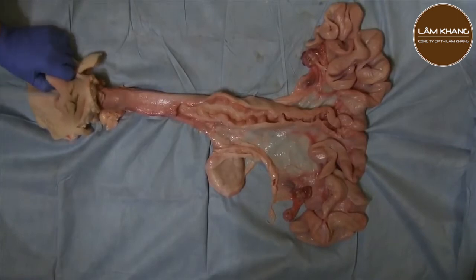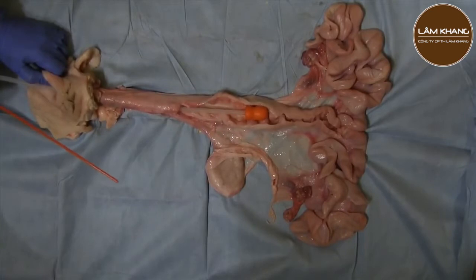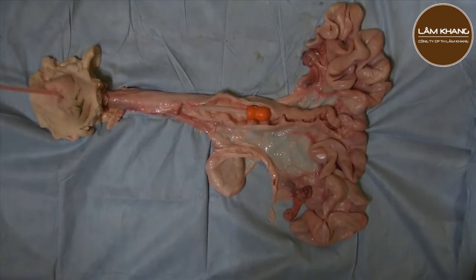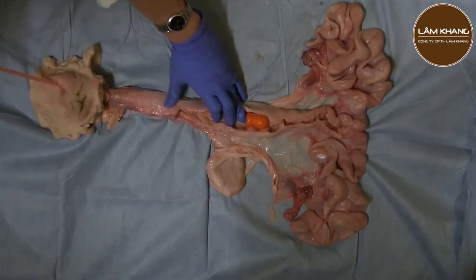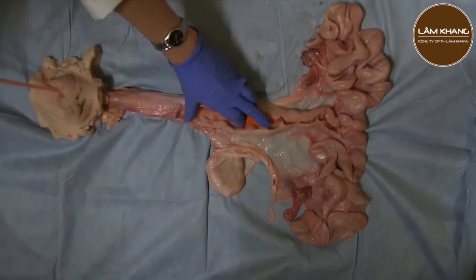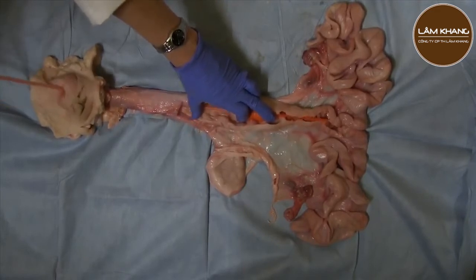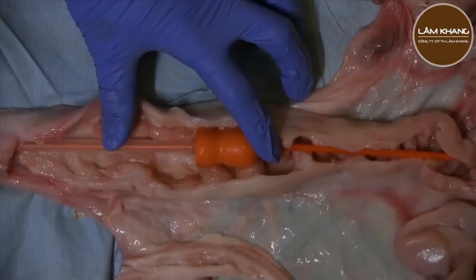During PCAI, a foam tip or spiral-tipped outer catheter is inserted into the vulva through the vagina and placed in the first two interdigitating pads of the cervix. This is where the catheter would end if using traditional AI. The smaller inner catheter is then threaded through the outer catheter. It is passed through the remaining interdigitating pads of the cervix and lands in the uterine body. These smaller catheters can typically easily pass through the lumen of the cervix into the uterus. Then a semen dose can be deposited into the uterine body. So let's show you how this process works on a live animal.